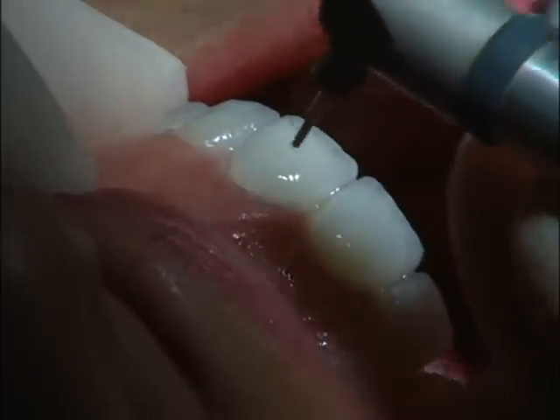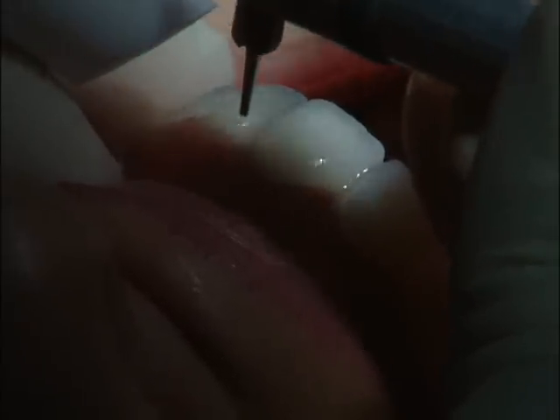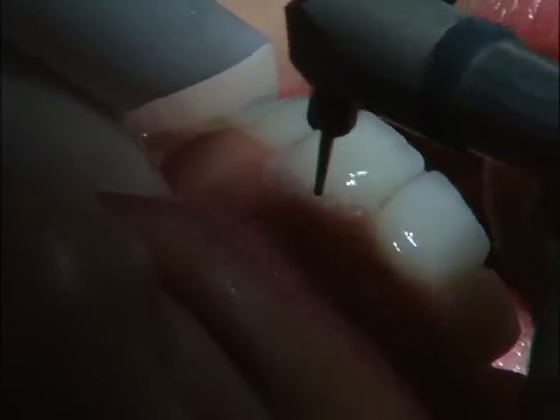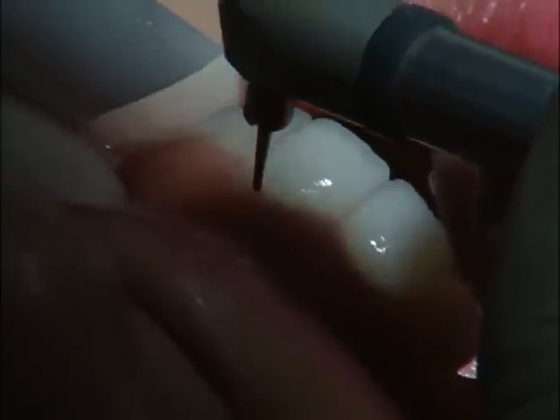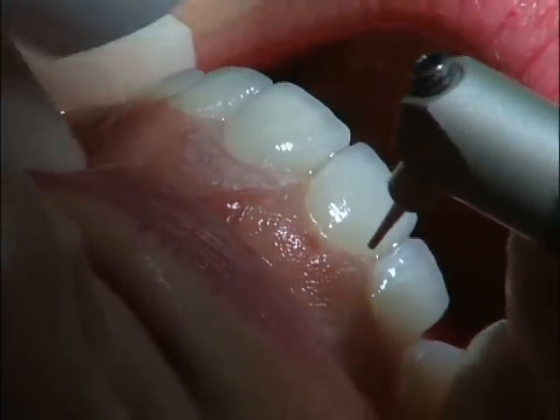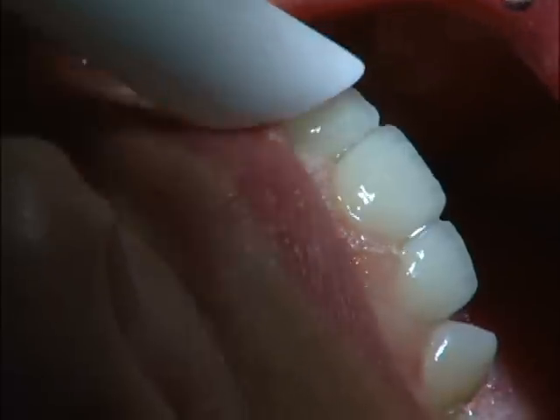Now I'm going to come back and lightly dehydrate the tissue. I'm going to put the tissue on the outside. See the painting motion. And when you see the tissue turning frosty in color — see that? I can do the same thing over here. And all I'm doing now is just making sure that the tissue is nice and sterile, free of any potential problems.